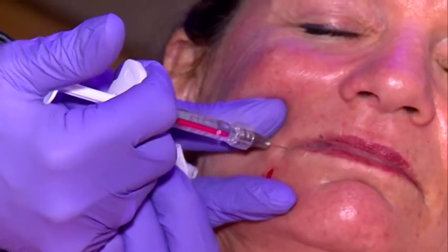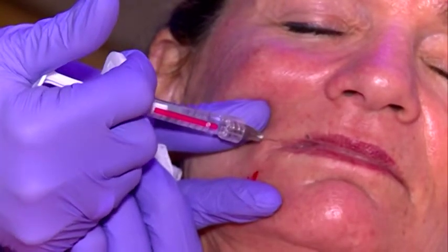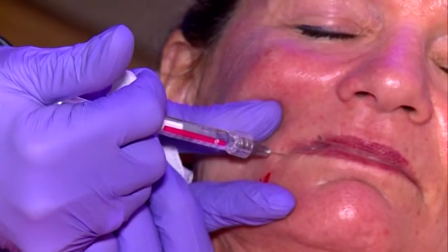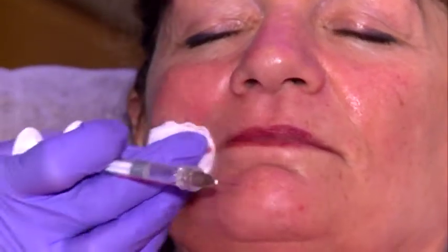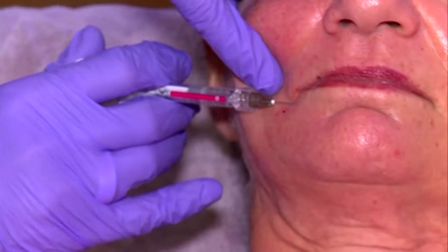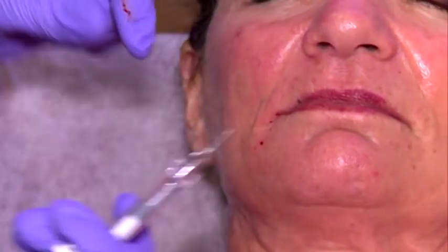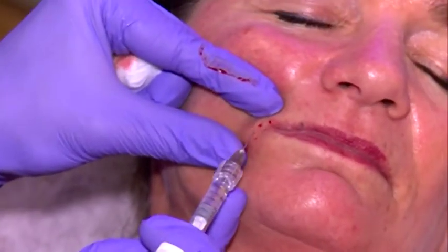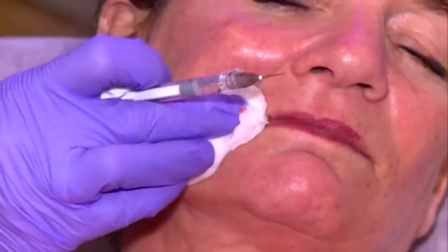Sorry, one is here. She doesn't like it. It's in the lip. She has nothing on it. Sorry, second one, almost done, and the third one. And this should elevate the corner of the mouth. And then I'm doing one more line here, just to support it. Oops, can you turn like this for them? Thank you. And one more line here. And then we are done.